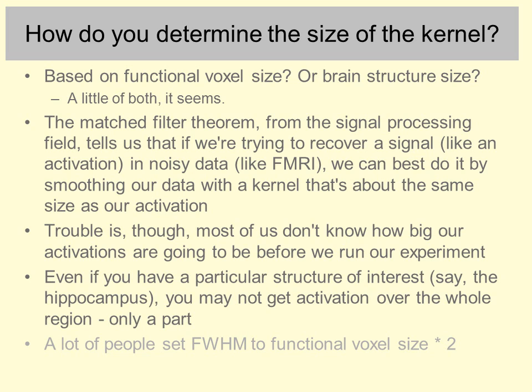Now, a default that a lot of people use is to set the full width half maximum of the spatial smoothing to the voxel size times 2, and that seems to work fairly well for most exploratory studies.